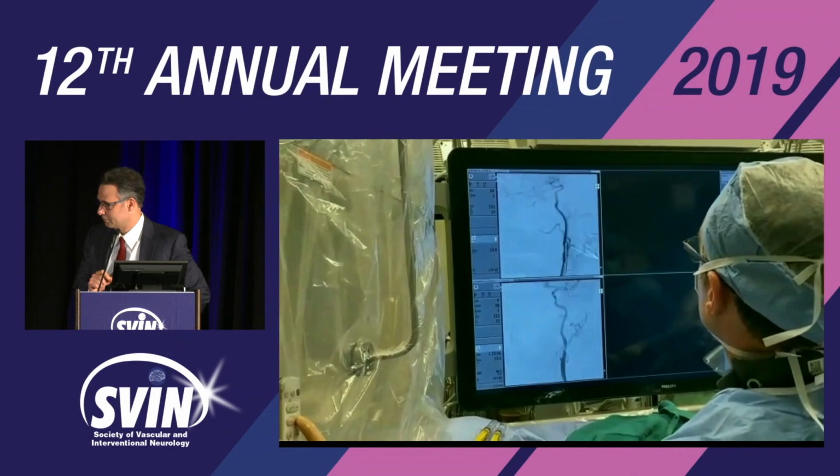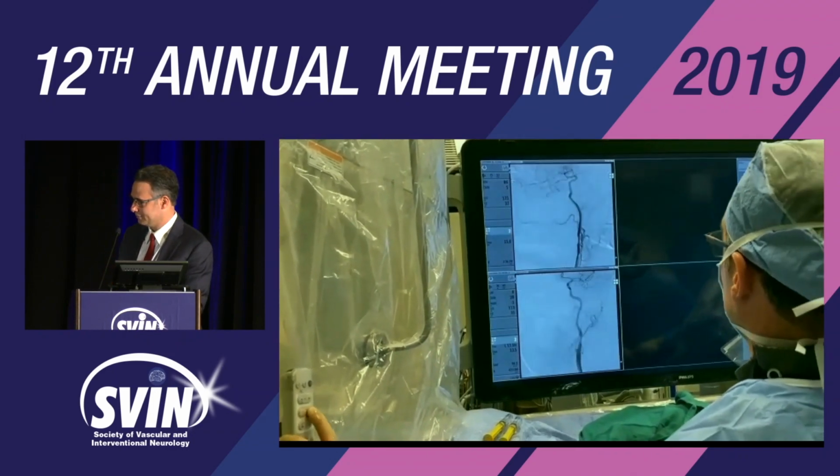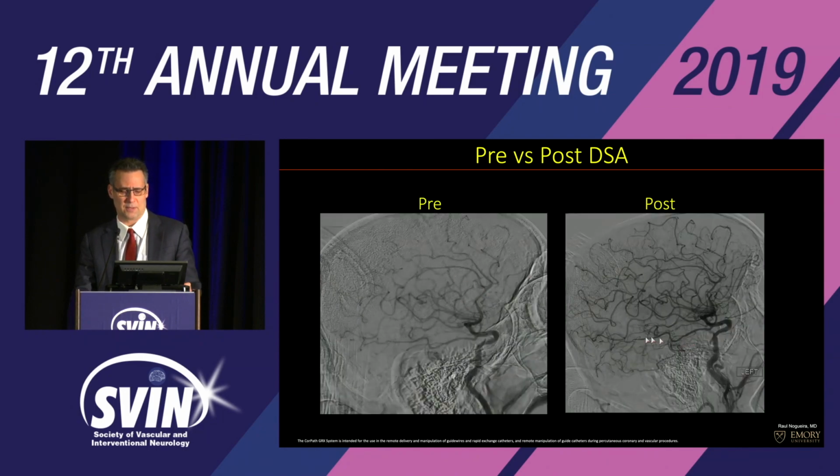What advantage do you find with the robot? Because I see only radiation reduction. So there are a few things that deserve mention. Let me just finish showing the results here so you can see the before and after. Before and after, no residual stenosis when you compute here the differences.